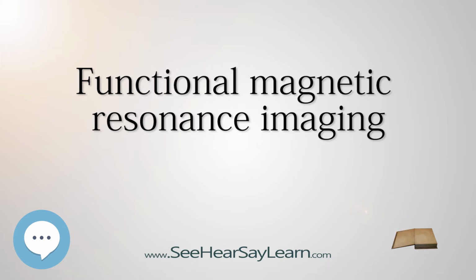A complex cognitive task may initially trigger high-amplitude signals associated with good performance, but as the subject gets better at it, the amplitude may decrease with performance staying the same. This is expected to be due to increased efficiency in performing the task. The BOLD response across brain regions cannot be compared directly even for the same task, since the density of neurons and the blood supply characteristics are not constant across the brain. However, the BOLD response can often be compared across subjects for the same brain region and the same task.